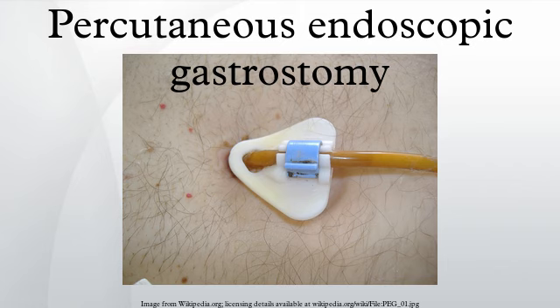PEG administration of enteral feeds is the most commonly used method of nutritional support for patients in the community. Many stroke patients, for example, are at risk of aspiration pneumonia due to poor control over the swallowing muscles. Some will benefit from a PEG performed to maintain nutrition. PEGs may also be inserted to decompress the stomach in cases of gastric volvulus.